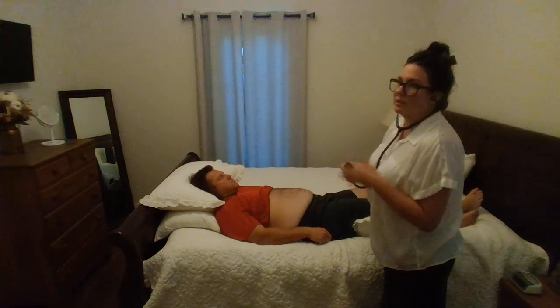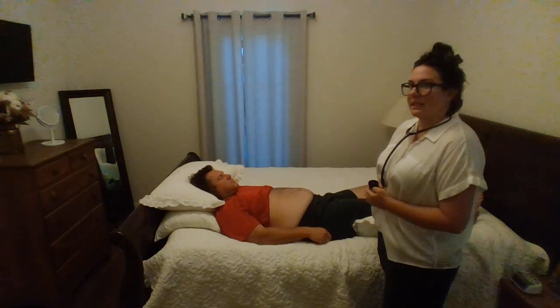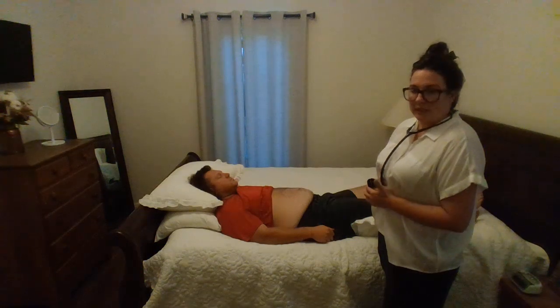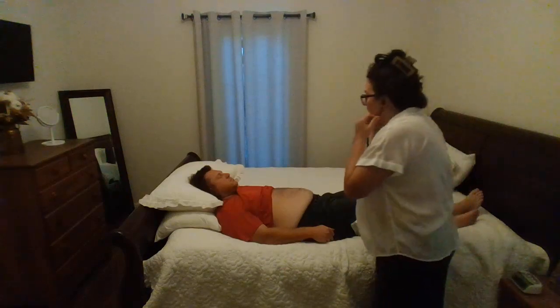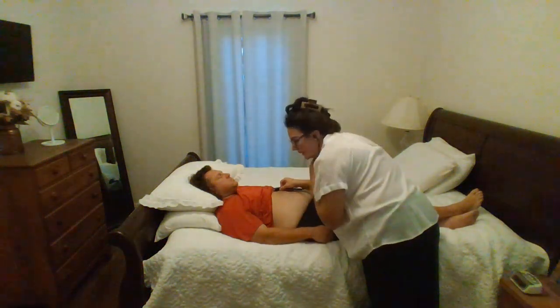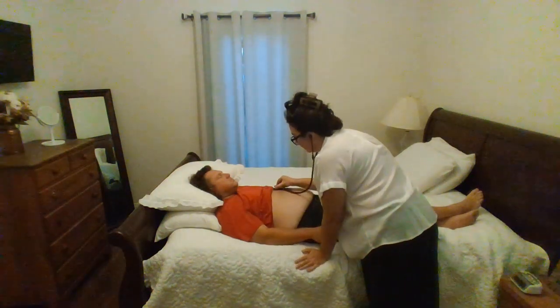of my stethoscope, I'm going to auscultate his aorta to make sure there's no bruits. That would indicate turbulent flow. Also going to auscultate his right and left renal arteries for the same thing, make sure there's no bruits, turbulent flow. Going to auscultate his right and left iliac arteries and his right and left femoral arteries. So the aorta is going to be epigastric area, center, midline, listening with the bell. Don't hear any bruits. I'm going to switch to the diaphragm.